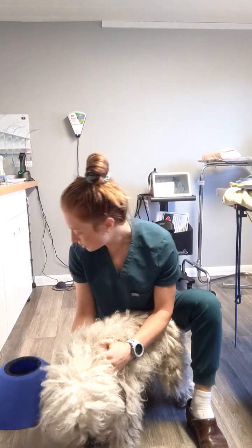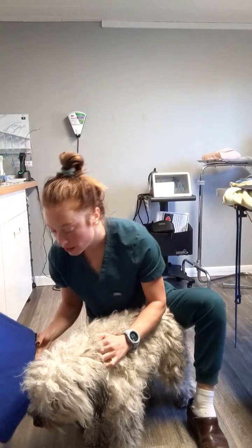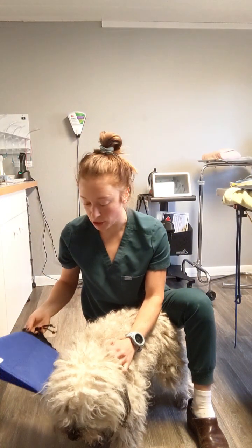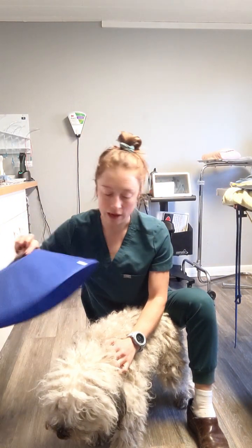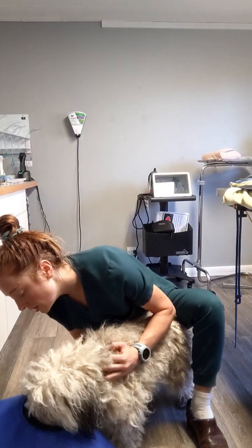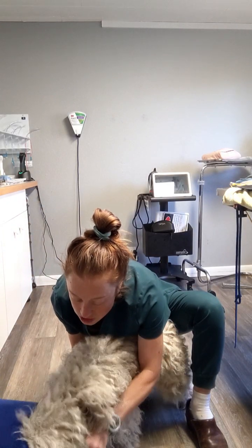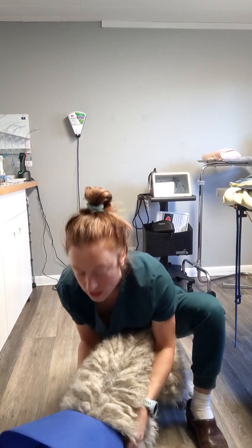To apply an e-collar, kind of similar to the muzzle, I want to make sure I line up the e-collar and just make sure that it would be a good fit. So I want to make sure that it's going to extend past her nose but isn't so big that it's super burdensome. So ideally I'm applying it from kind of behind. I'm securing her against my body and just encouraging her to put her nose through the hole, which she did, and then there we go, and just assist that to slide onto her head.